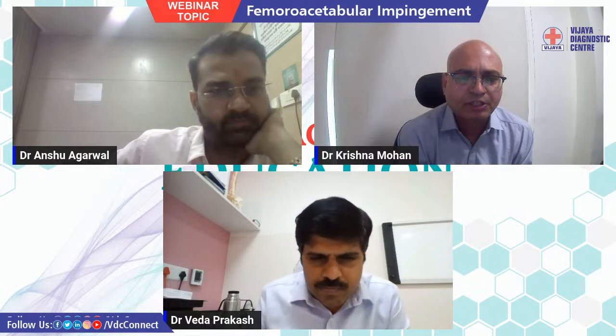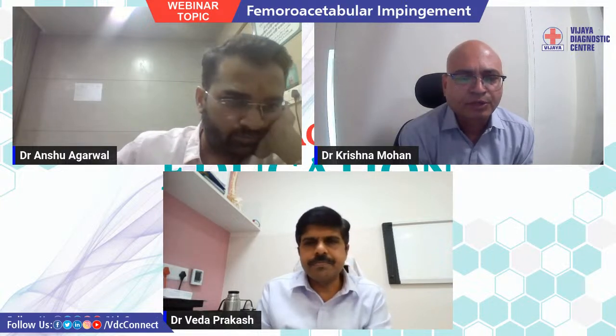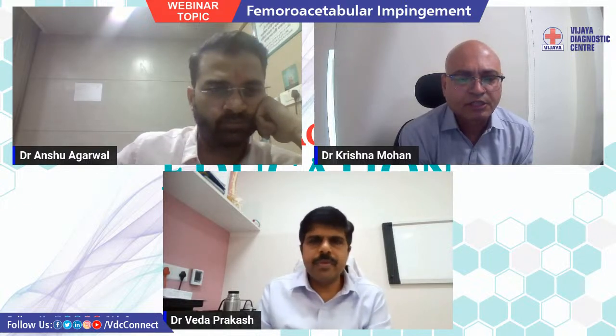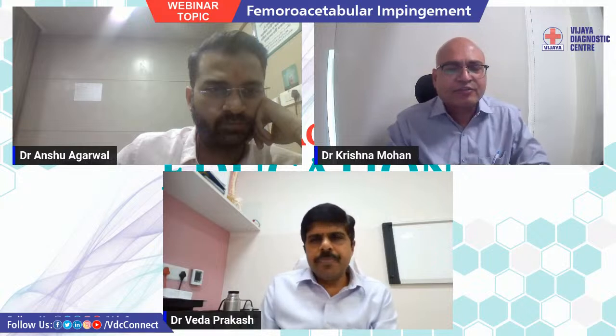Yeah, I think with 3 Tesla MRI with very high resolution imaging, we can detect the labral tears very clearly. Other than that, if the quality of the MR is not good, I think we have to go for an MR arthrogram. But with 3 Tesla MRIs, we can see the chondral lesions, chondrolabral tears and labral detachments. But we have to look for those things dedicatedly. We cannot just see them casually. We have to think that there is an FAI and look for a labral tear.